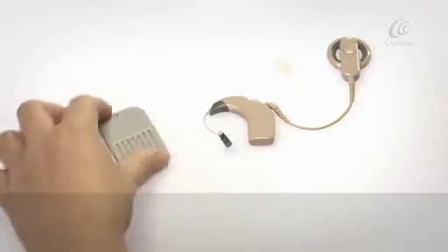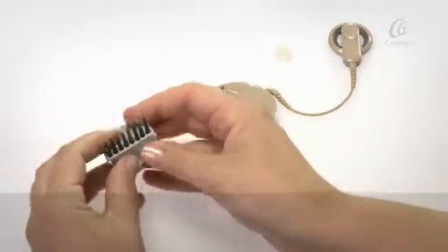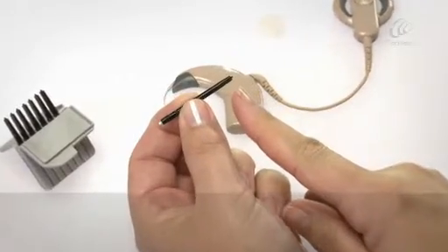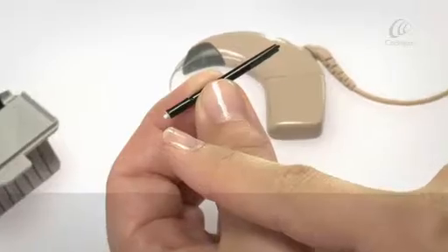Remove a new Wax Stop tool from its shell — one with the new filter.